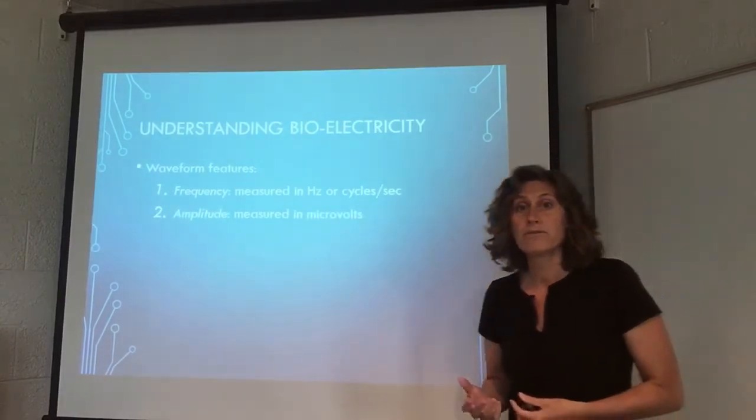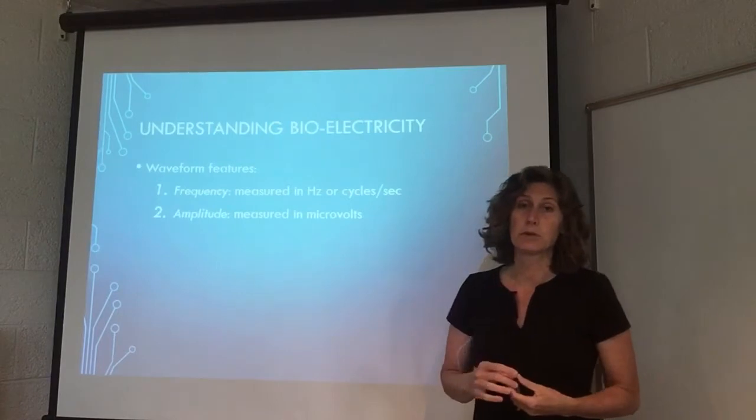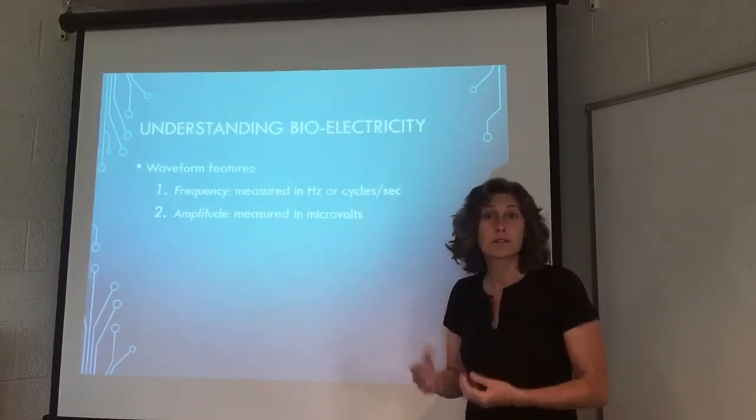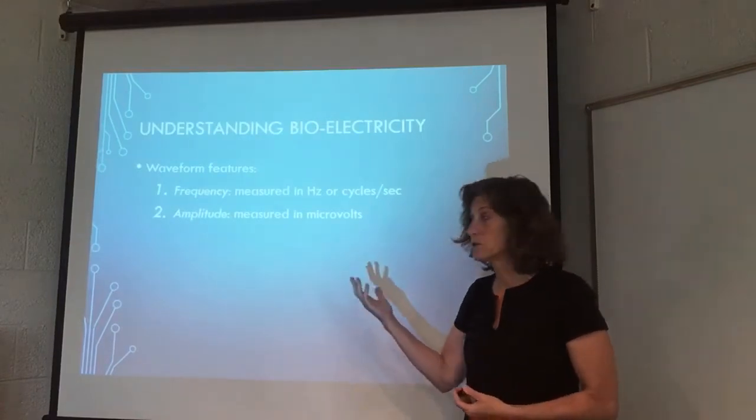The other key waveform feature that we're going to be analyzing is amplitude, and that's just the height that the waves reach. So that should be fairly intuitive. It's measured in microvolts.